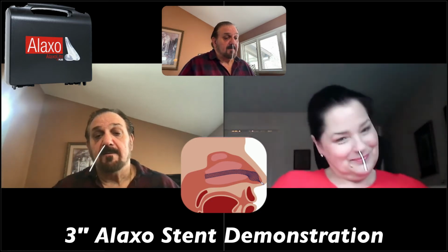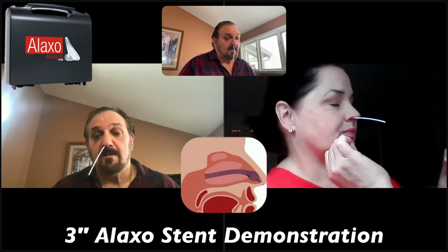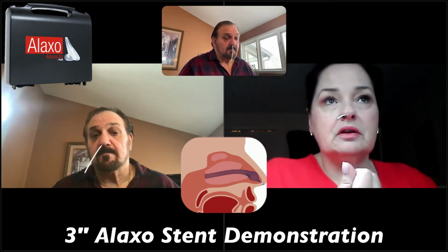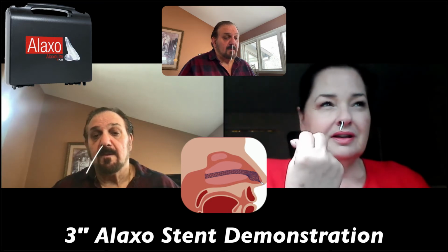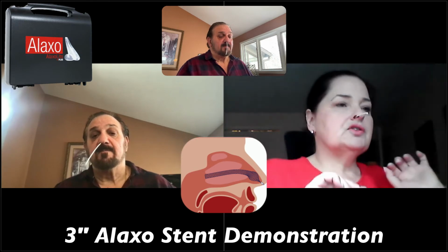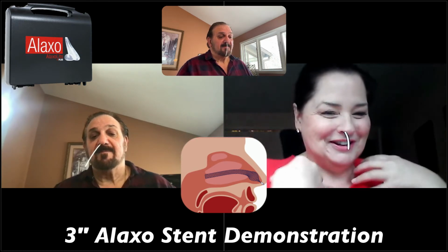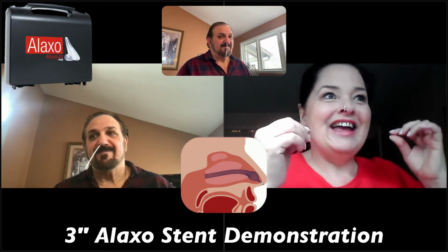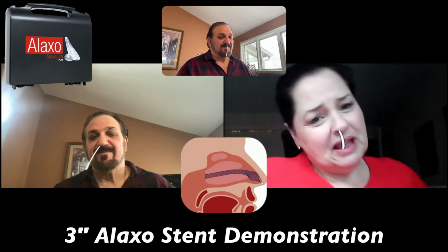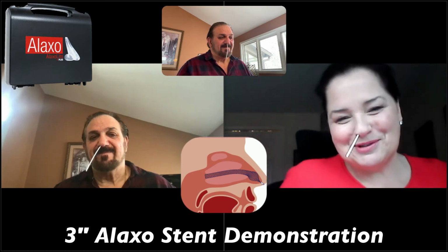When you pull back the tube, the introduction tube, it's going to expand. So you're going to feel pressure, tingly, a little stingy. I found when I first did it, that's when my eyes started watering and all the mucus came. So just so that you know, it's not painful. It's just such a strange feeling that you've never experienced before.